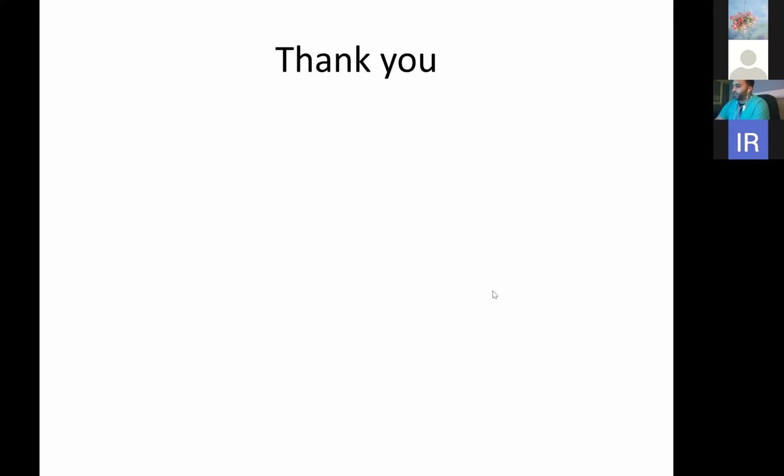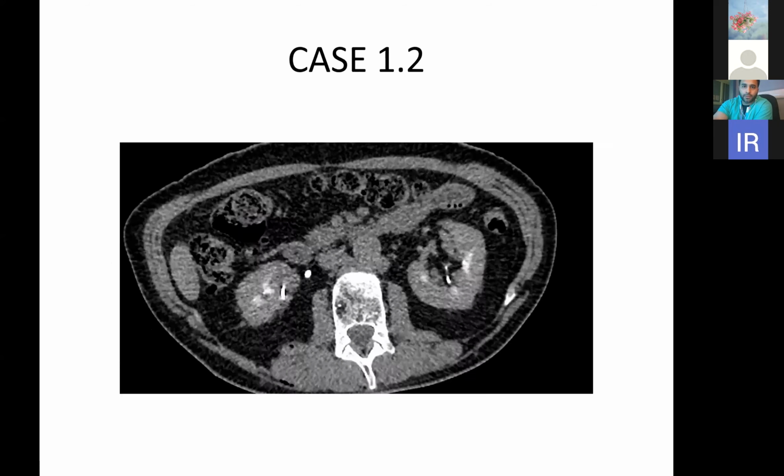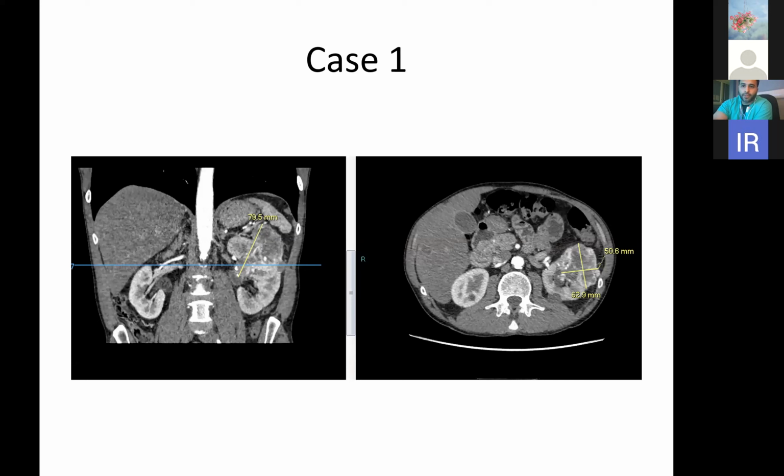Okay. Yeah. So remember the case that I showed you with regards to the RCC? If I go back to the previous slides. Yeah, so your question is, how would I characterize this lesion on CT or ultrasound? Is that right? Yeah, or any lesion, like how would you approach it, and what would be going through your mind?